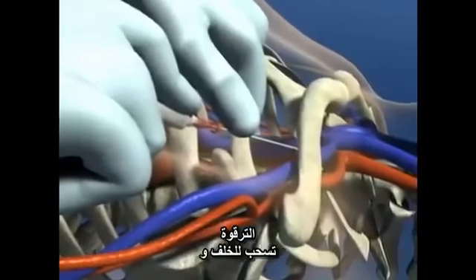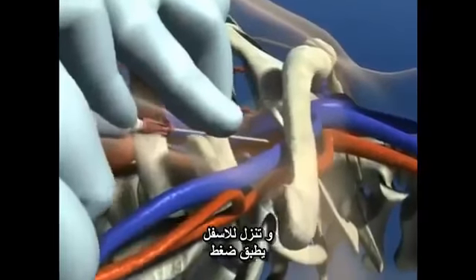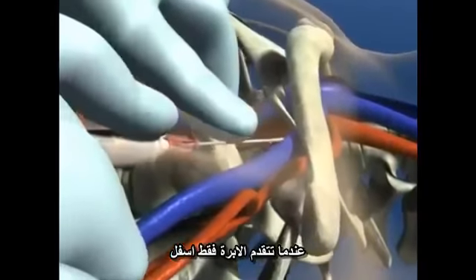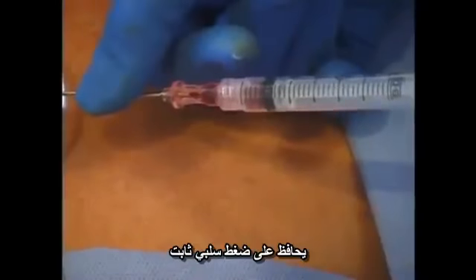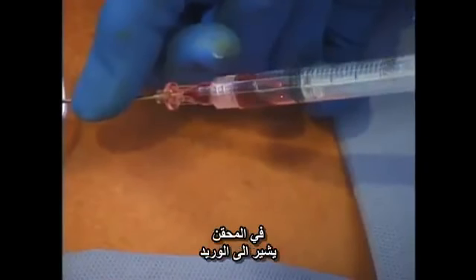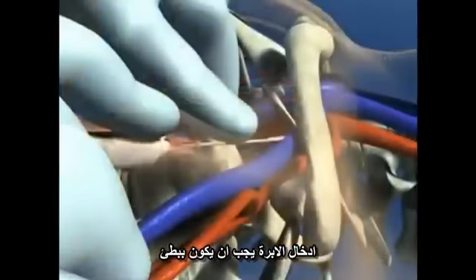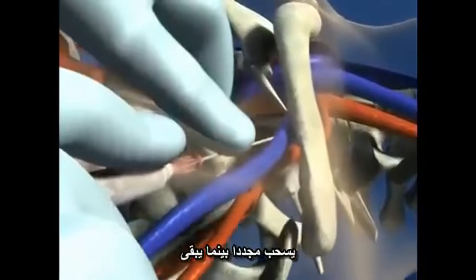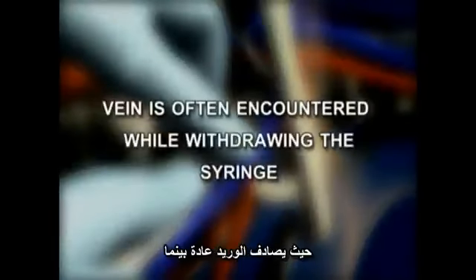After gently touching the clavicle, the needle is pulled back and further downward pressure is applied as the needle is advanced just below the clavicle. While this is being done, constant negative pressure is maintained in the syringe, and a flash of blood in the syringe indicates the vein has been entered. If no flash of blood is encountered, the needle is slowly withdrawn, again while maintaining negative pressure in the syringe, as the vein is often encountered while withdrawing the syringe.